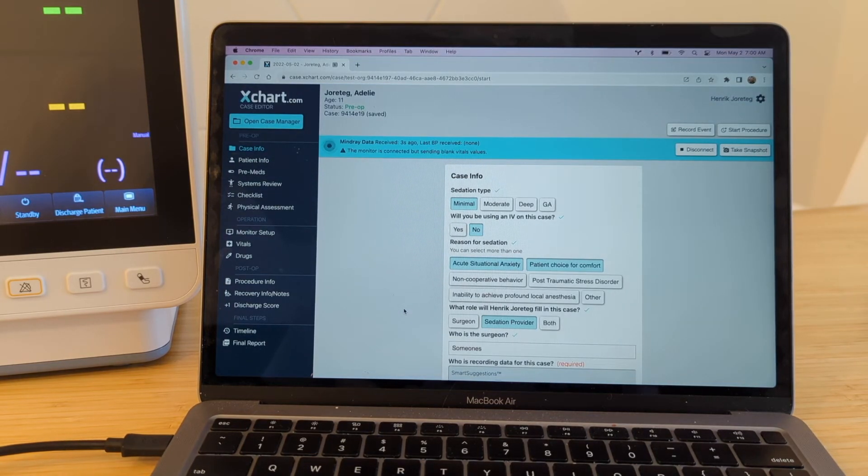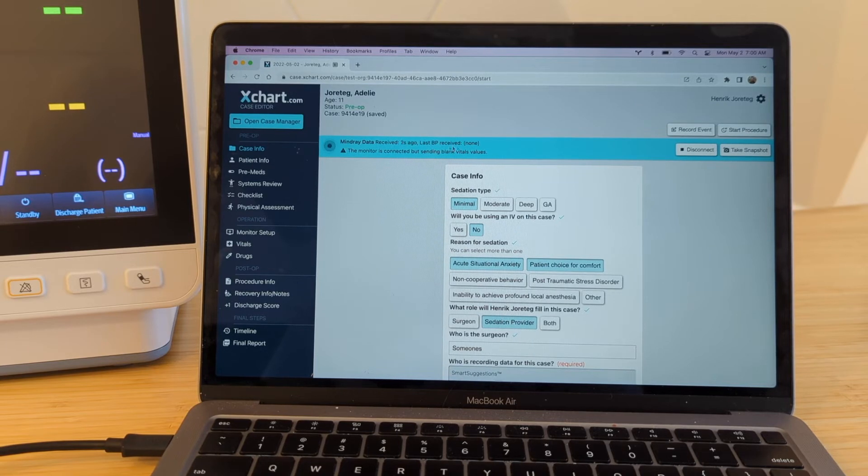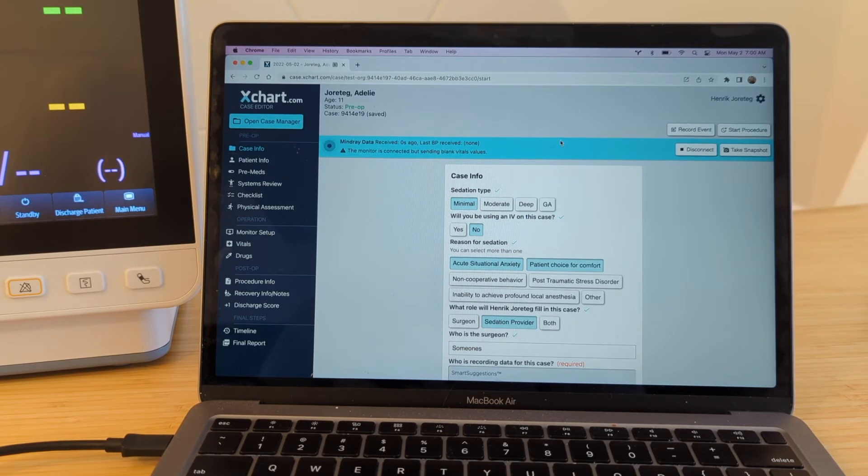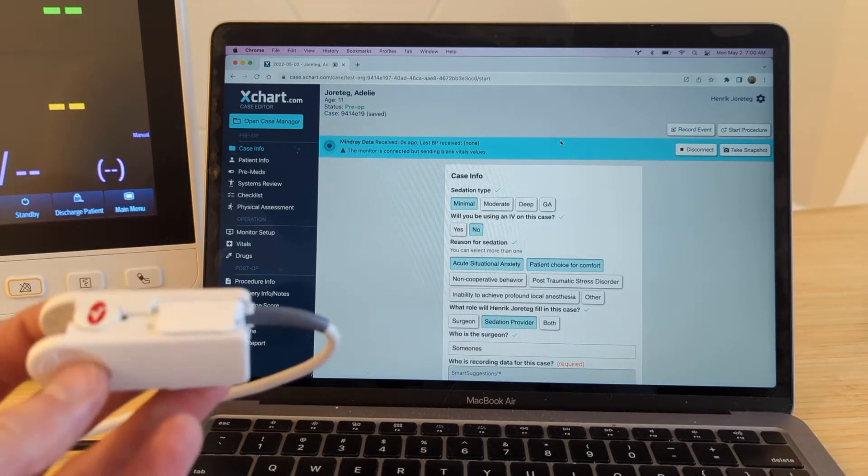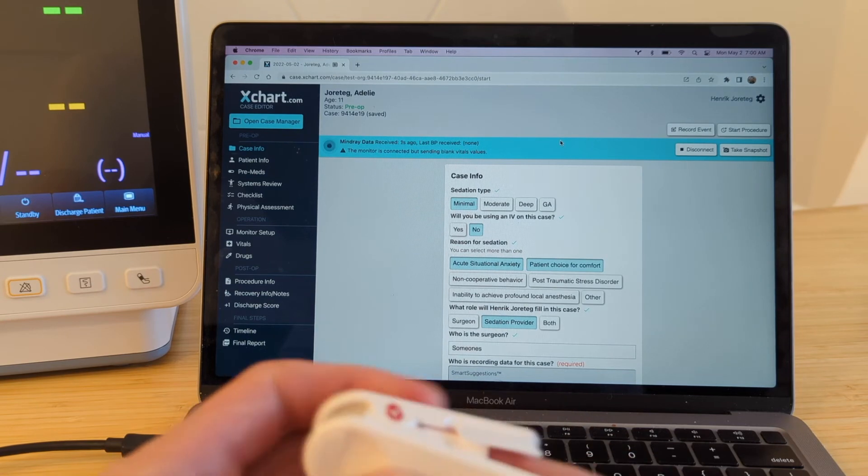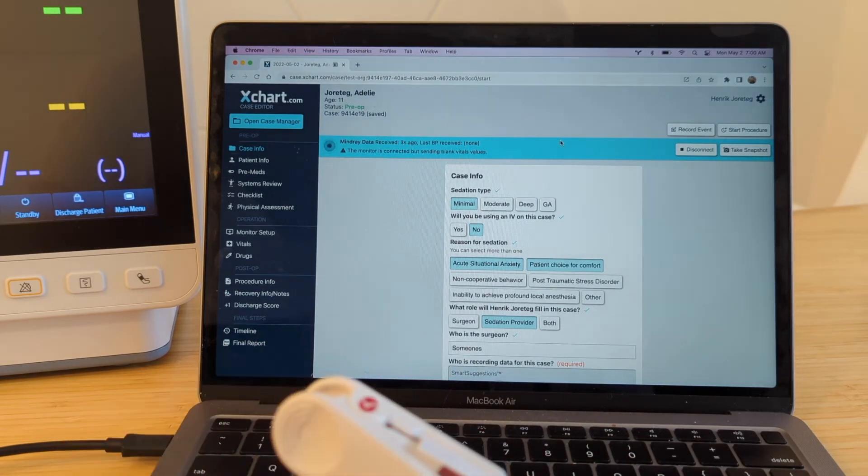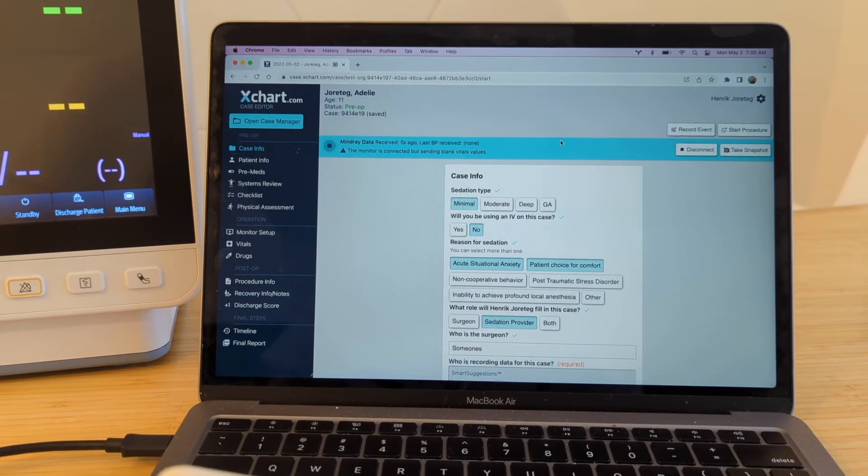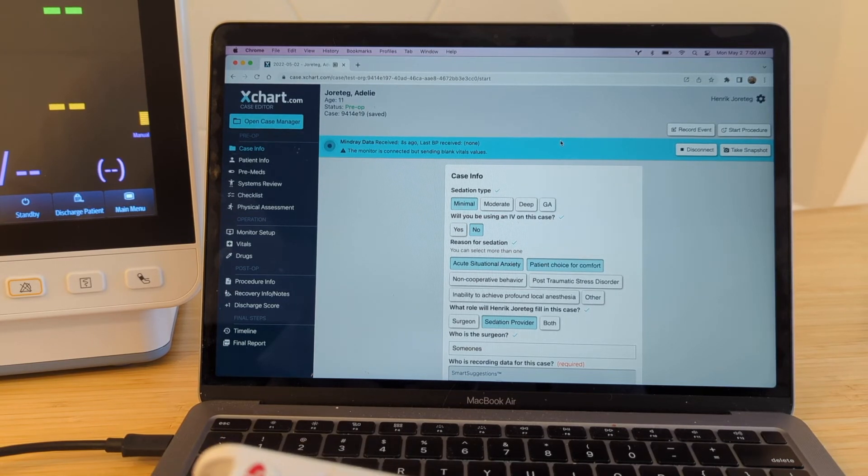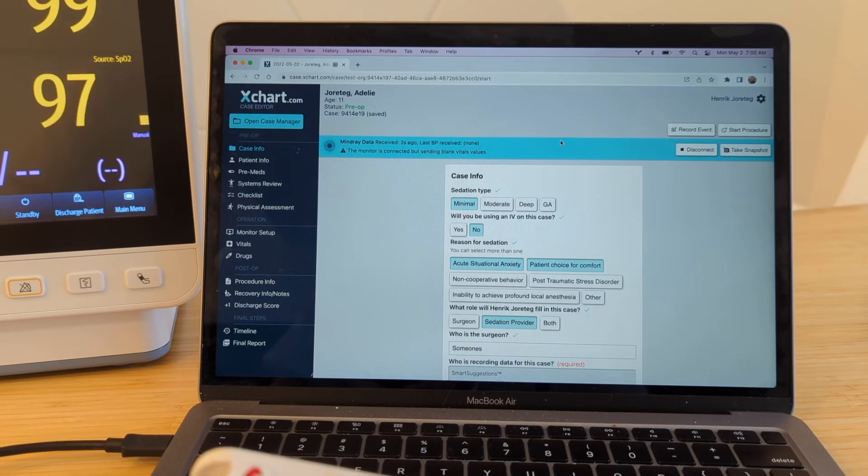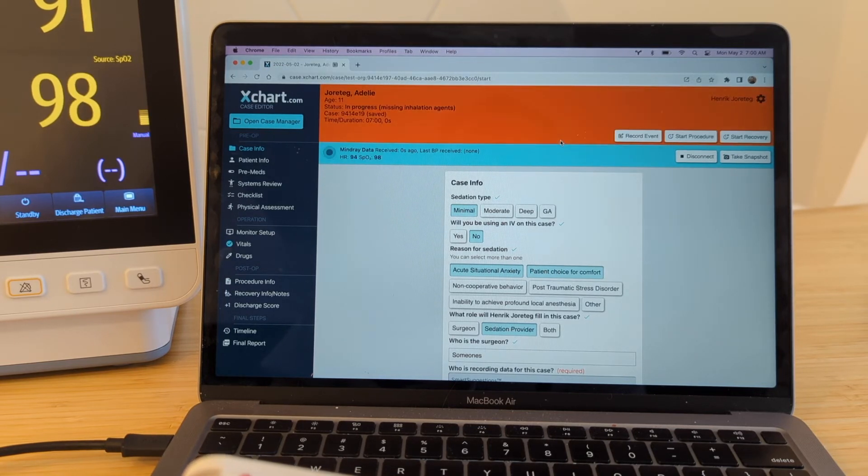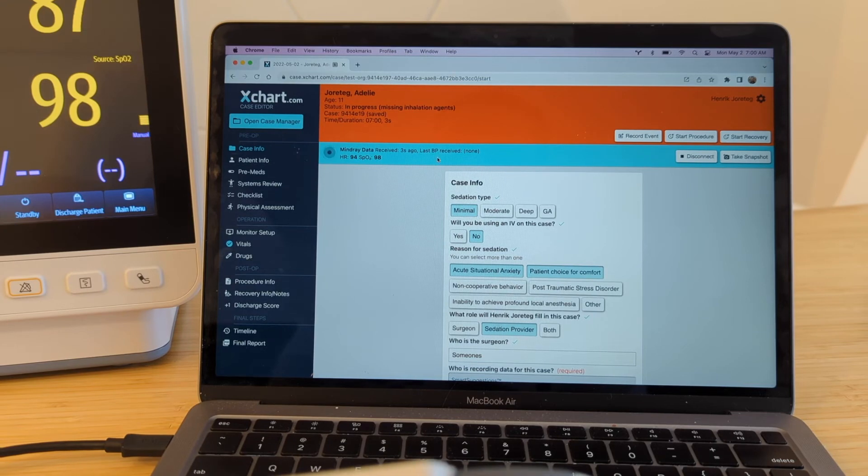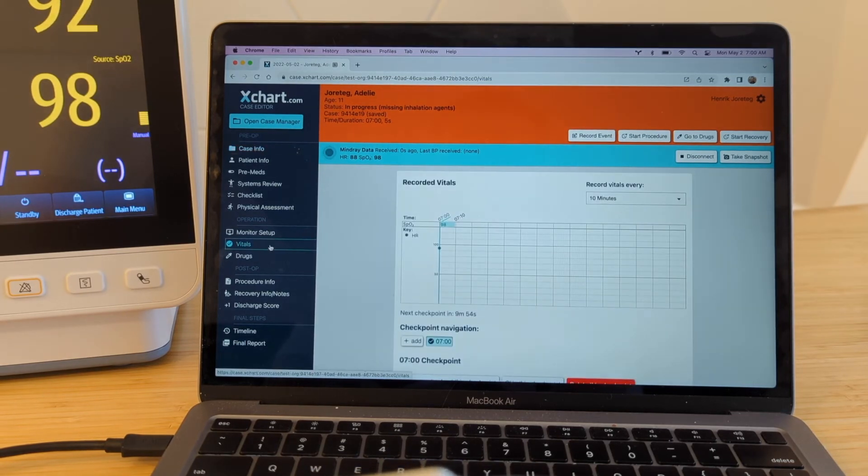And at this point, if you bring in the patient and you sit them down and you start hooking up sensors, so here I have just an SPO2, as soon as it gets a real value from one of these, I'm going to put this on my finger, it's going to just start recording it. Of course, it takes a second for it to recognize the SPO2. There we go. It should now show up. And there it is. So as soon as it does that, if you go over to vitals, you'll see, first of all, we do have some data that we're starting to record here.